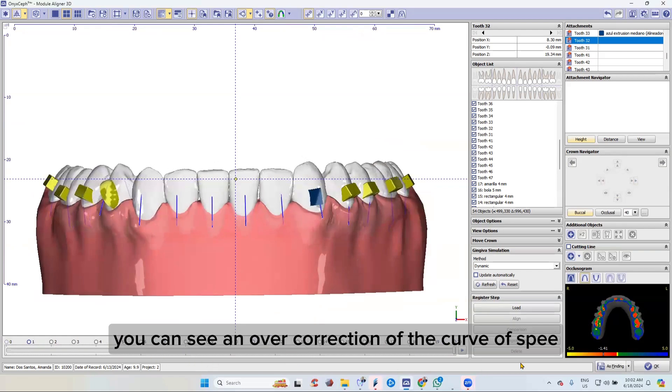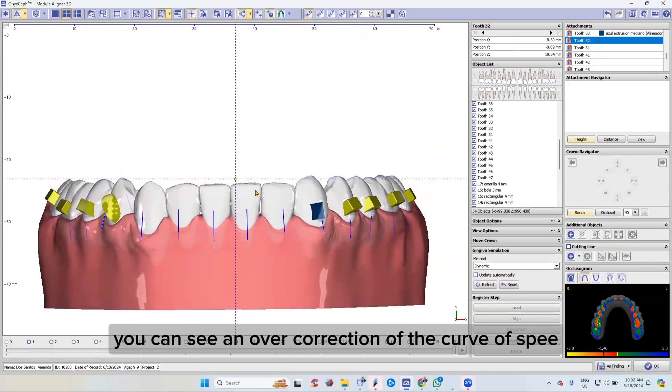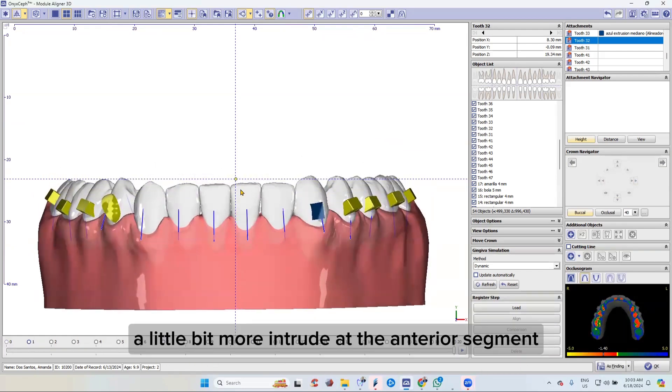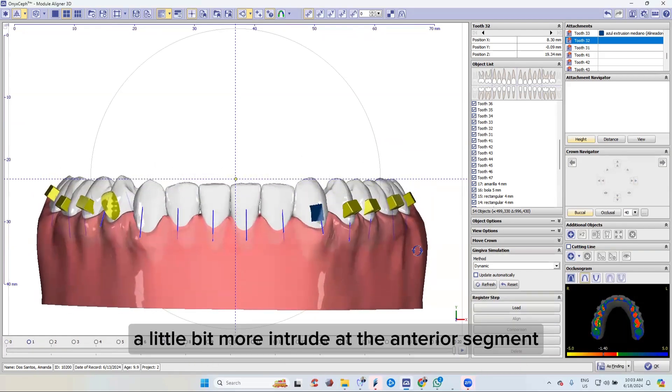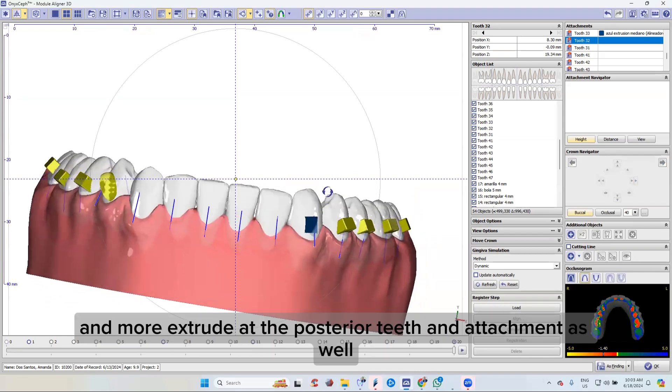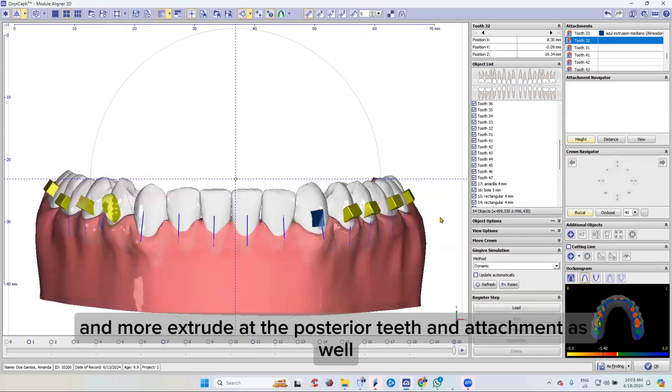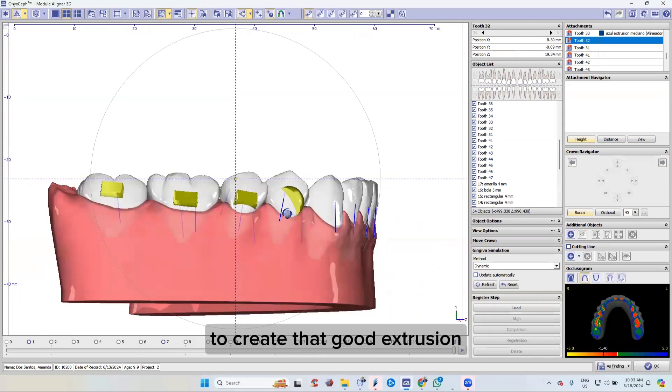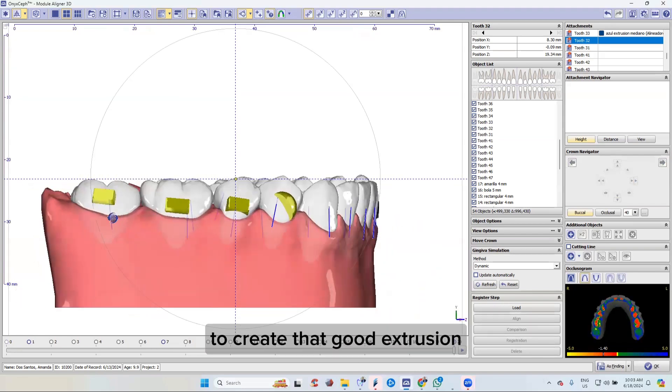You can see an overcorrection of the curve of Spee — the anterior segment is a little more intruded and the posterior teeth more extruded, with attachments as well to create that good extrusion.